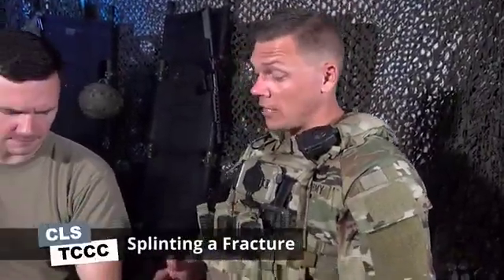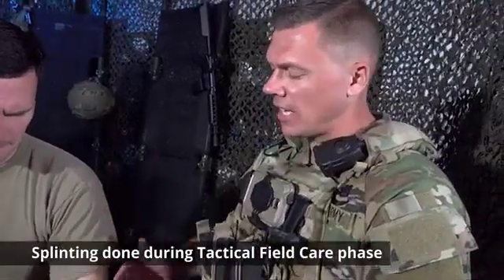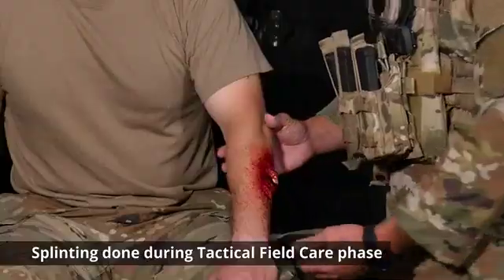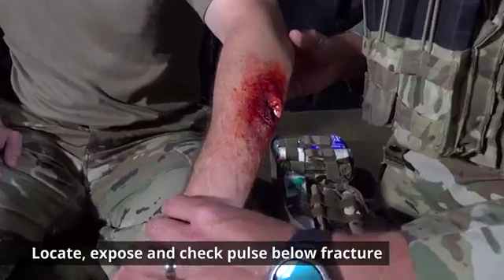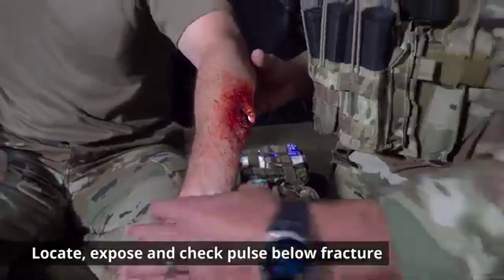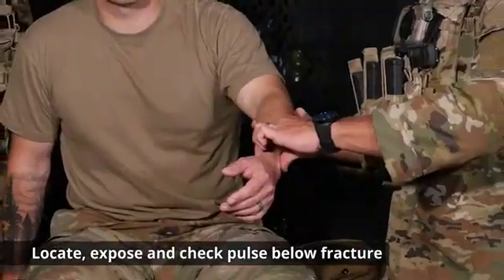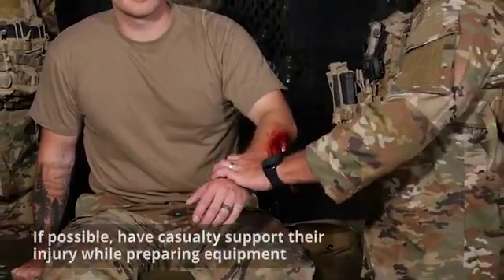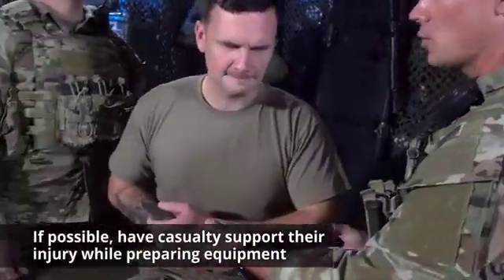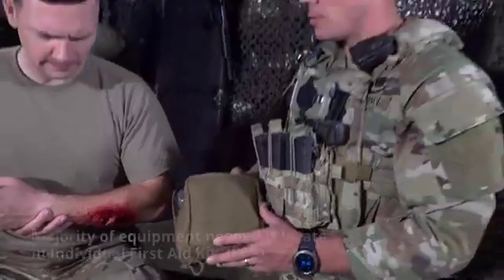Today we're going to talk about effectively applying a splint on a casualty during a secondary assessment in a tactical field care setting. We notice an open fracture on the patient's forearm. The first thing I'm doing is manipulating his wrist slightly and checking for a radial pulse — and on this patient I do feel a radial pulse. If he's conscious, I'd have him hold his wrist and support it.